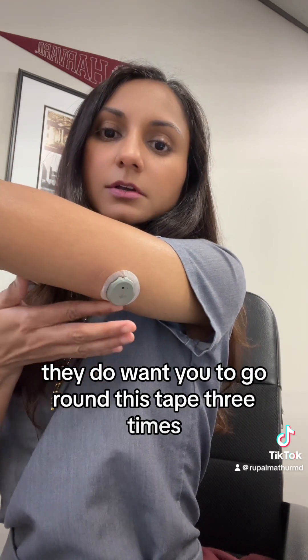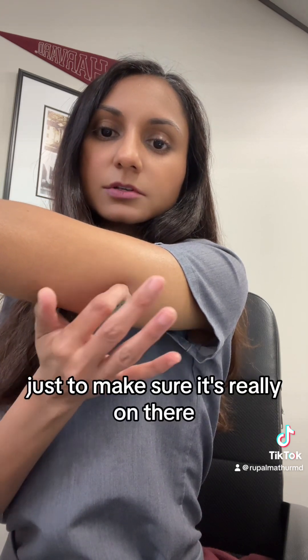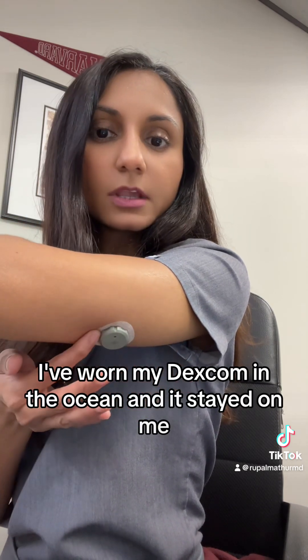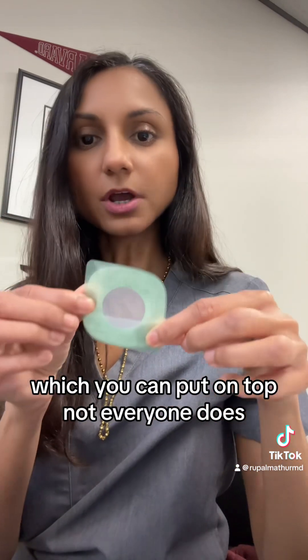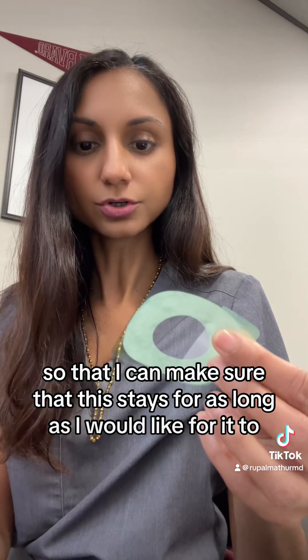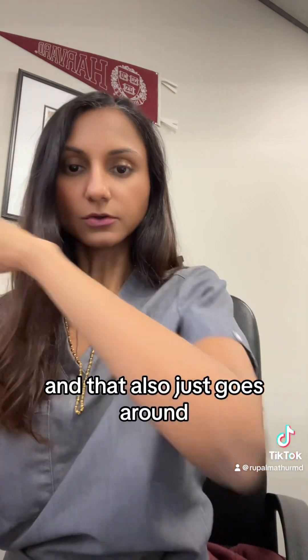They do want you to go around the tape three times just to make sure it's really on there. I've worn my Dexcom in the ocean and it stayed on me — you wear it in the shower too. They also want you to push down on the sensor for 10 seconds. It does come with an overpatch which you can put on top. Not everyone does, but I'm going to go ahead and apply it to make sure this stays on for as long as I'd like. That also just goes around the sensor.